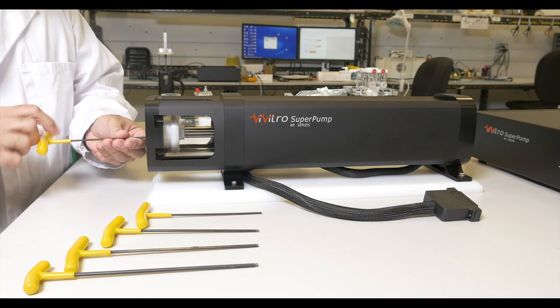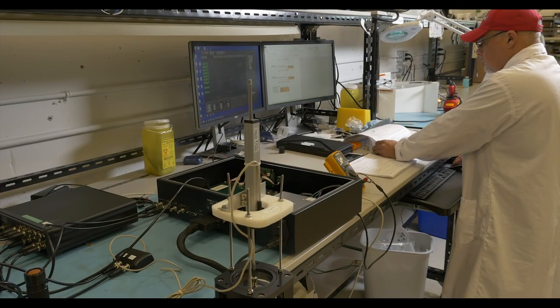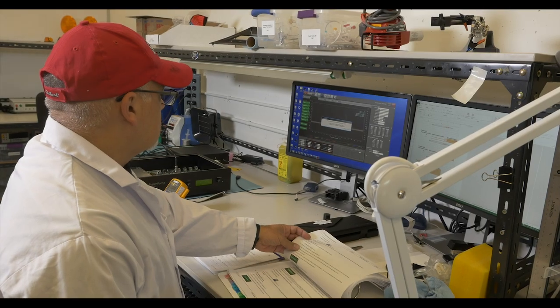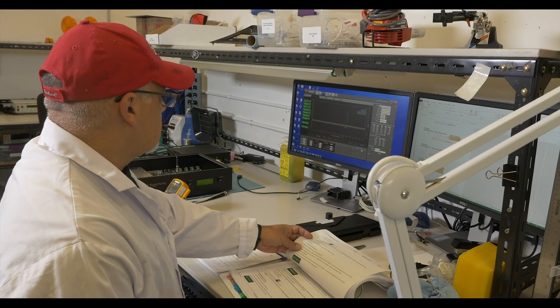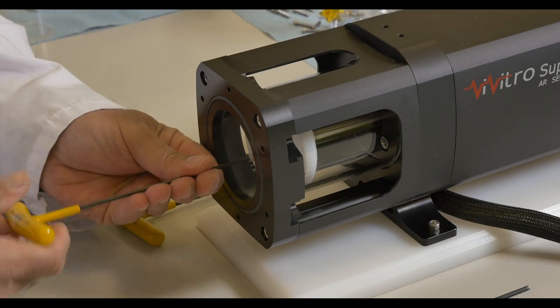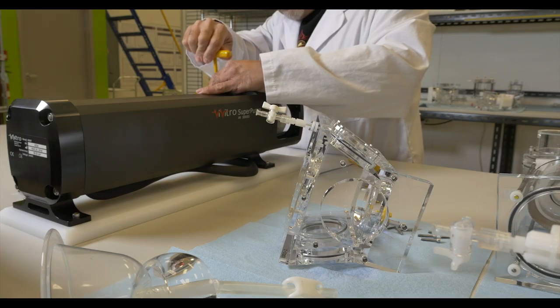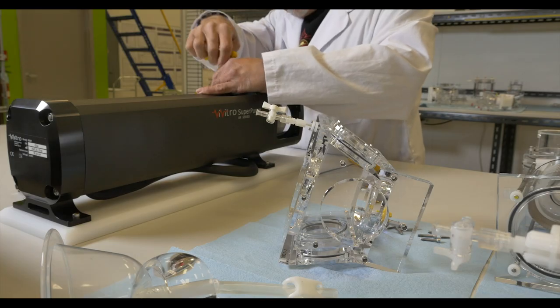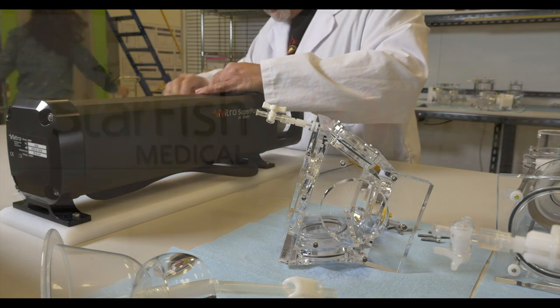Vivitro offers global on-site training, calibration, qualification, and consulting services for the super pump pulsatile pump. All Vivitro super pumps include a two-year warranty with optional extended warranties.